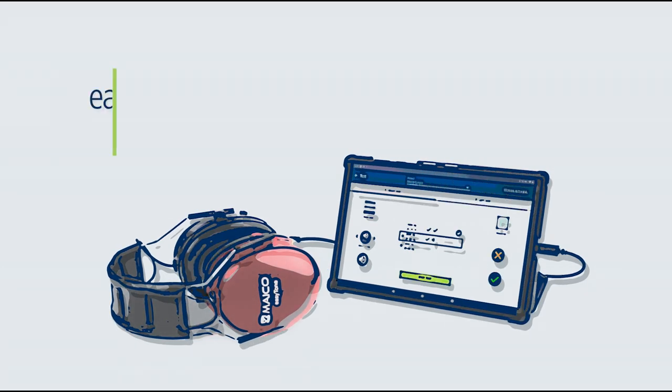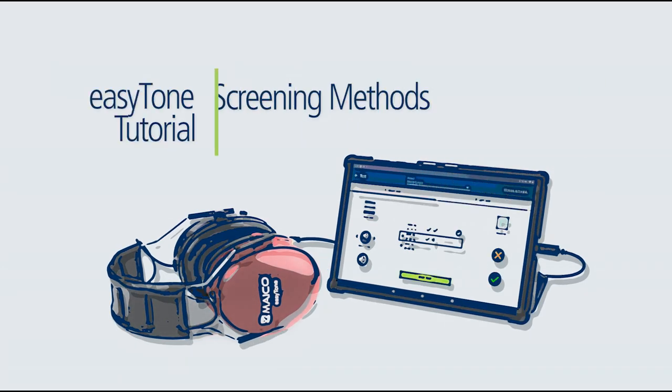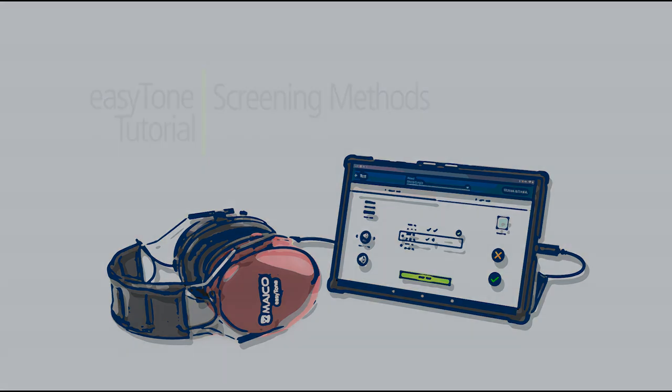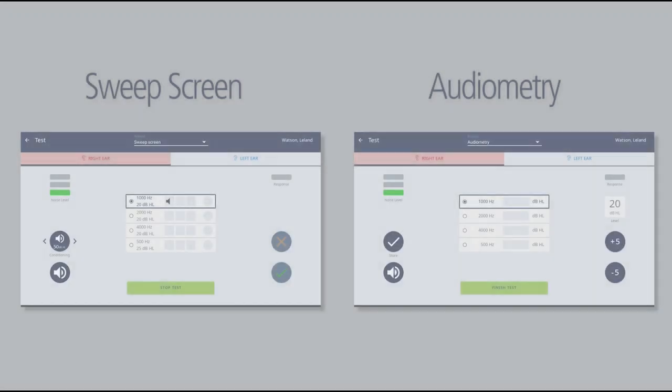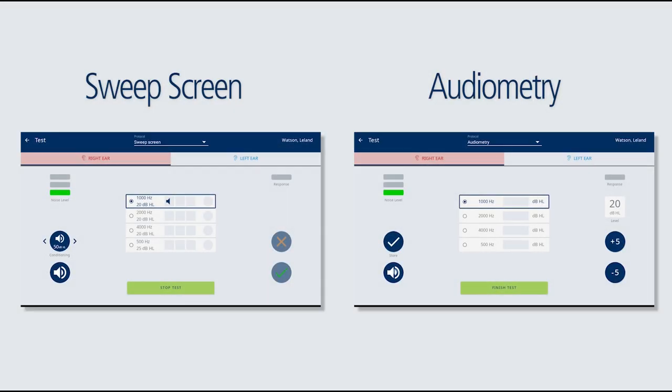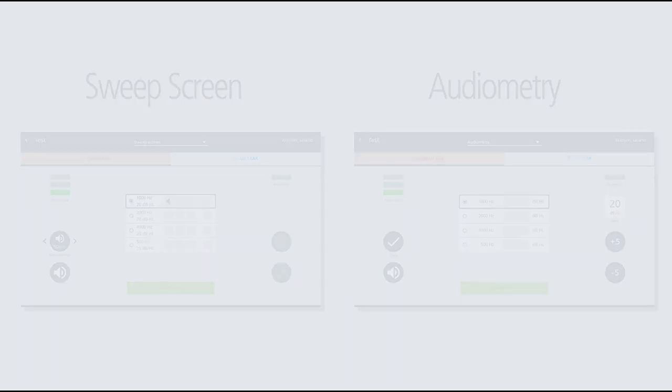This tutorial shows the different screening methods available within the EasyTone. The EasyTone offers two different screening methods to match your screening needs.